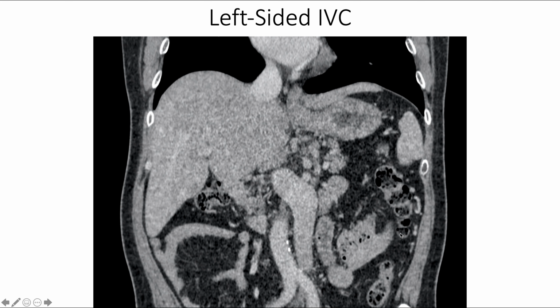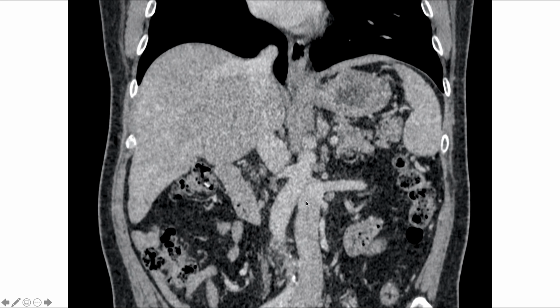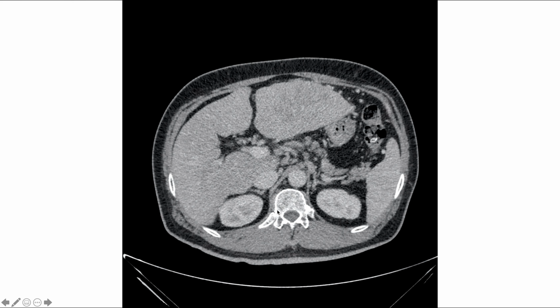If we move slightly anterior, we can better visualize the border between the two vessels, and again, the convergence of the inferior vena cava on the substance of the liver. In this case, the inferior vena cava is positioned to the patient's left, which is again not a typical anatomic structure. Normally, the abdominal aorta is positioned on the left-hand side.